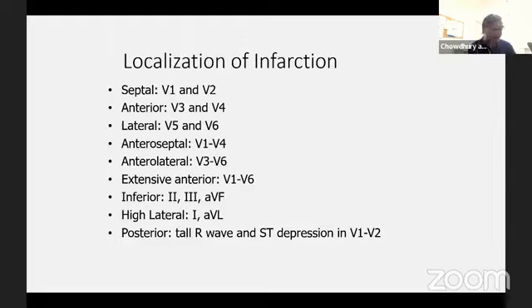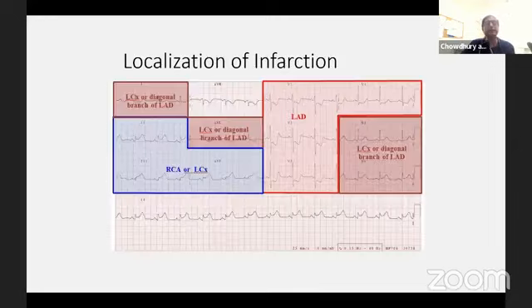We need to entertain many things. And it is equally important that we understand the EKG presentation when we talk about the infarct-related artery. There are many reasons for that, and it has important clinical and practical implications.